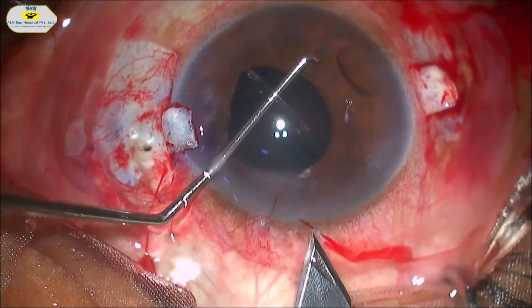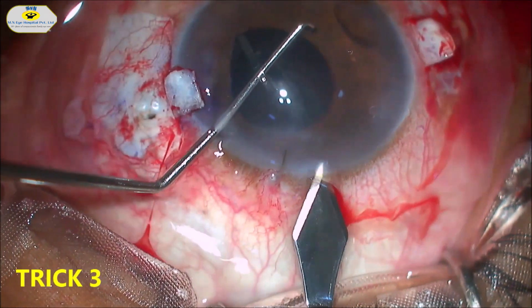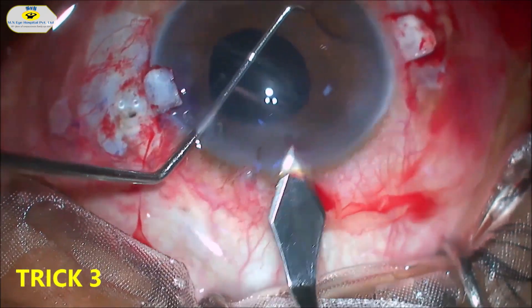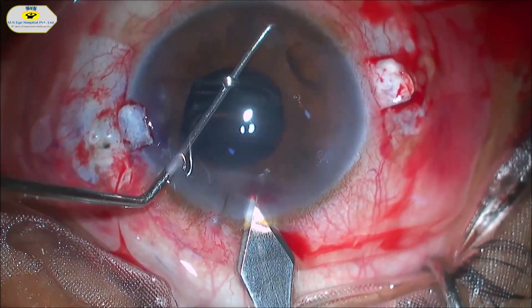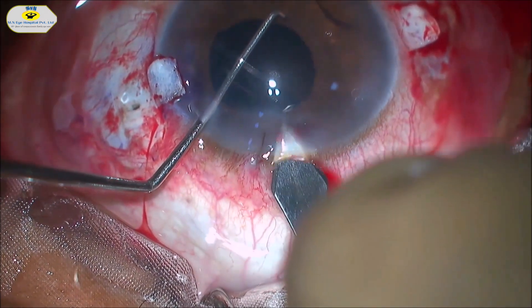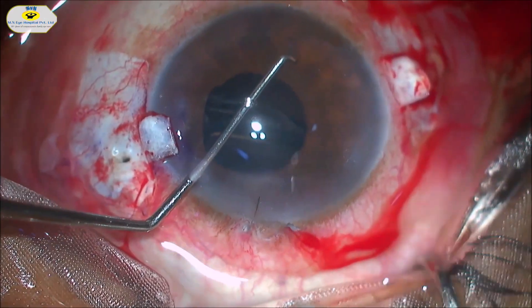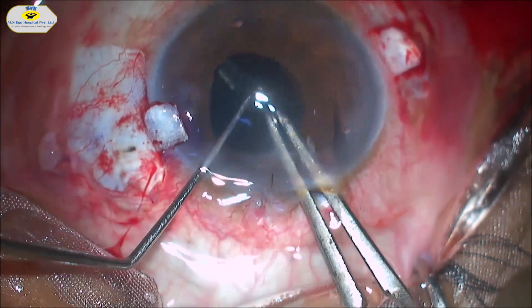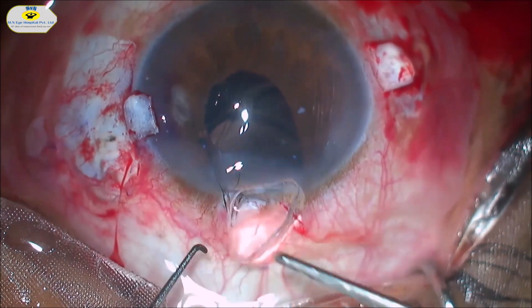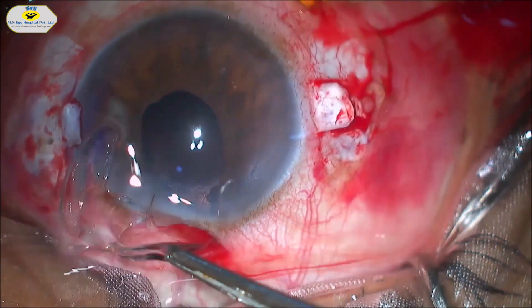In this case, instead of making a 5 mm incision we made a 3 mm sclerocorneal incision and extended it to a clear corneal tunnel, making entry into the anterior chamber. We can cut the IOL in half and bring it out, but here we brought the IOL out as a whole — care must be taken not to damage the iris.